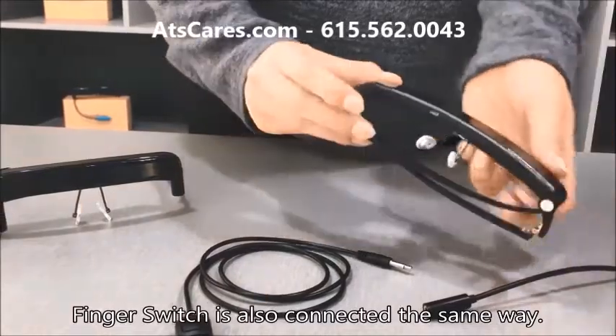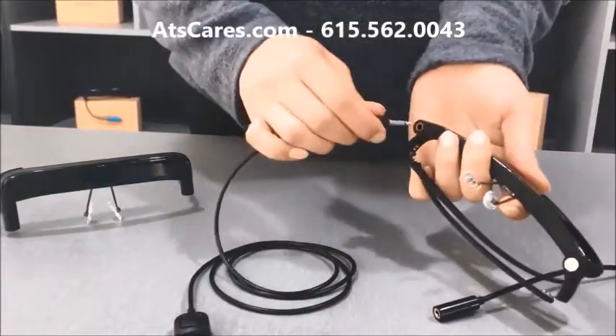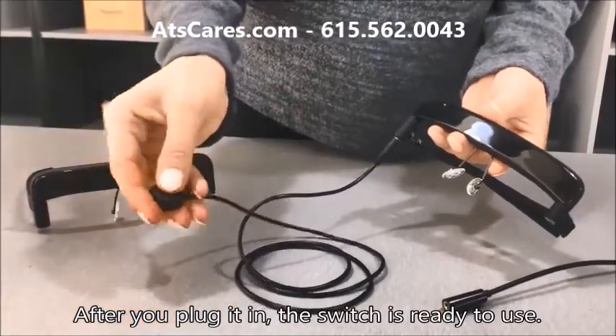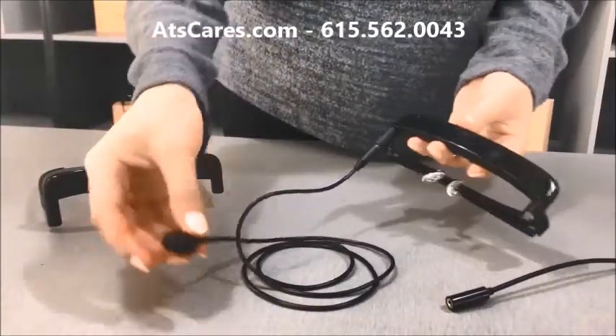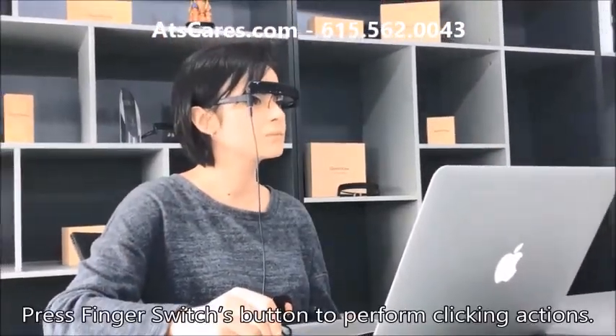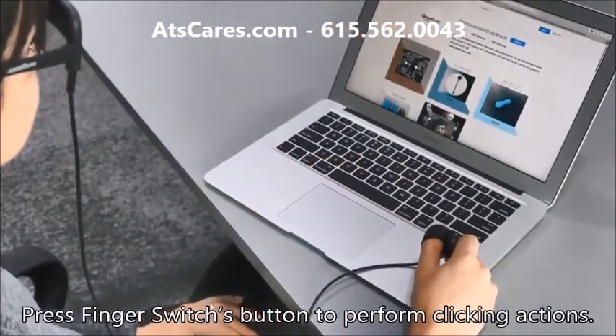Fingerswitch is also connected the same way. After you plug it in, the switch is ready to use. Press the Fingerswitch button to perform clicking actions.